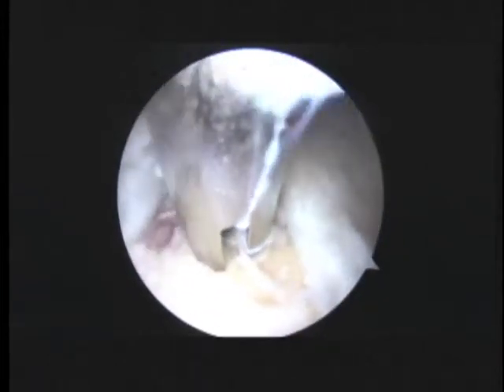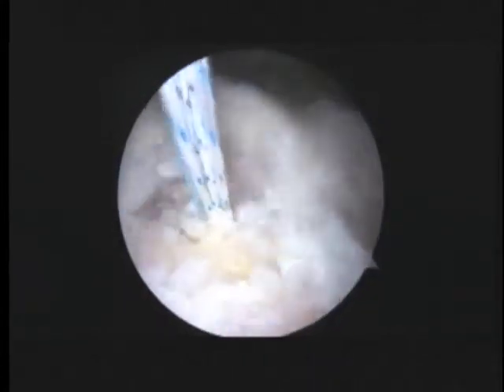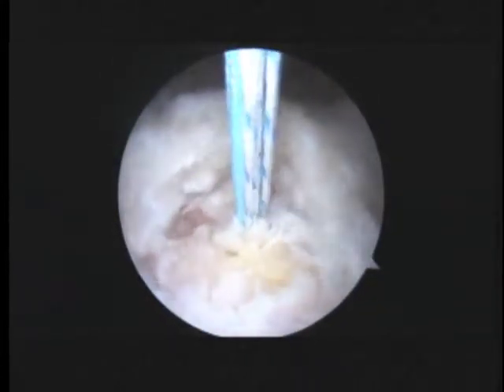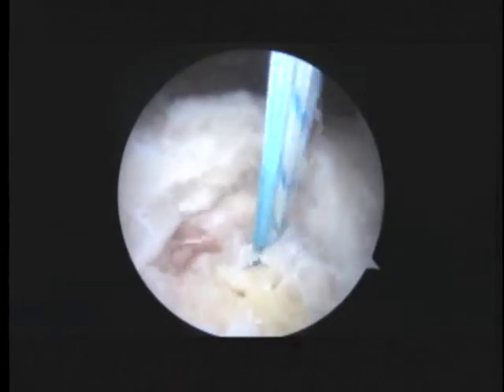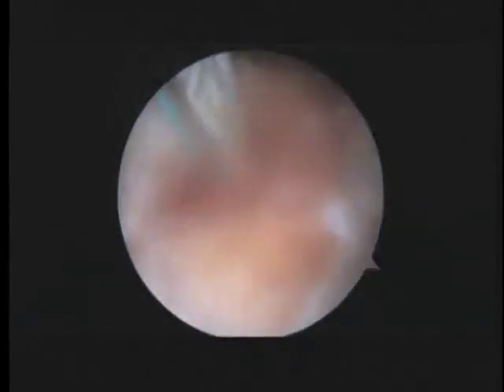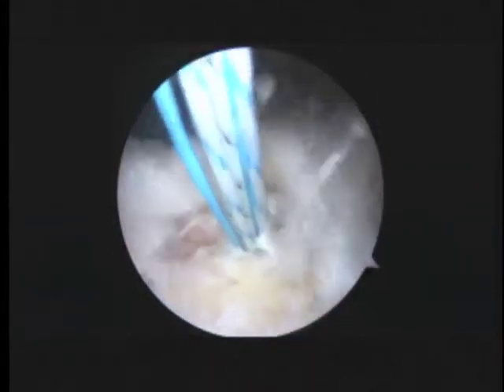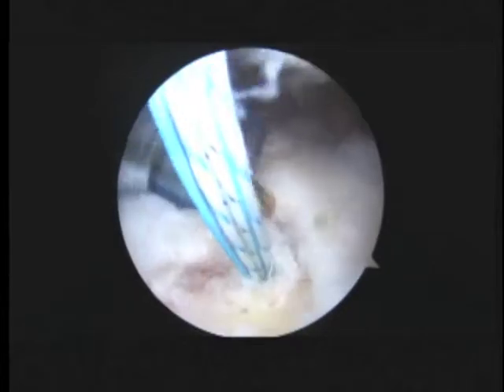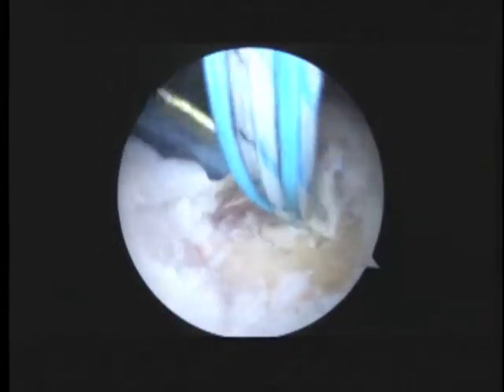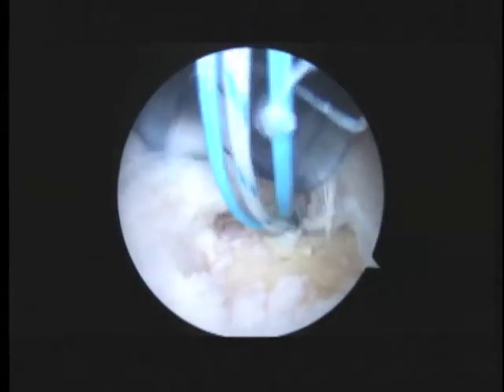And after pounding that down into the bone, we're going to go ahead and unload the inserter. And that gives us 3 sutures to work with. We'll seat the anchor by pulling tight. And that feels solid. And now we'll go ahead and start working with these sutures. So we're going to start on the left side of the screen. And we're going to take this blue and white suture. That's the first one we're going to work with right here.